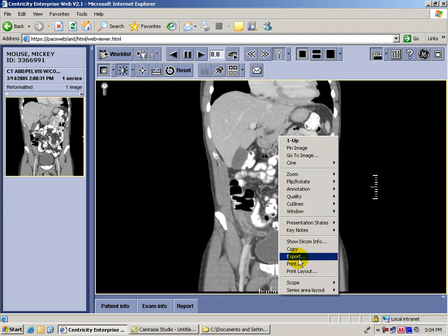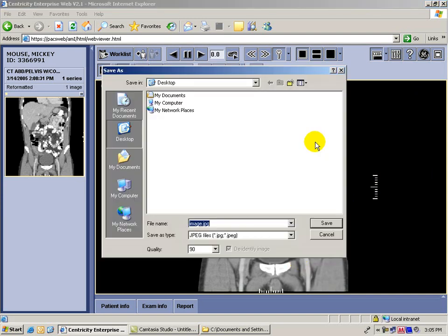You want to export it, and the default here is called image.jpg — it's a JPG file. The problem with saving an image as a JPG is that lossy compression occurs.